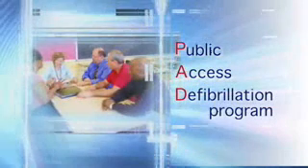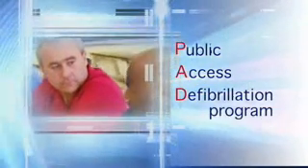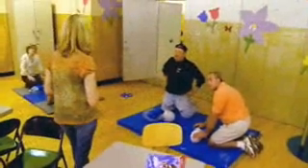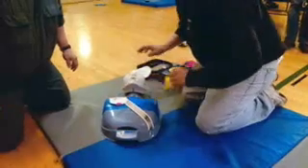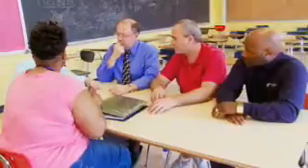To create an effective public access defibrillation program, first identify members of your emergency response team. Team members should include athletic directors, nurses, coaches, maintenance staff, teachers, students, parents, administrators, and other interested individuals who will be fully trained and certified to perform CPR and to use the AED. It is important to include team members who are available to support after-hours and off-site events.